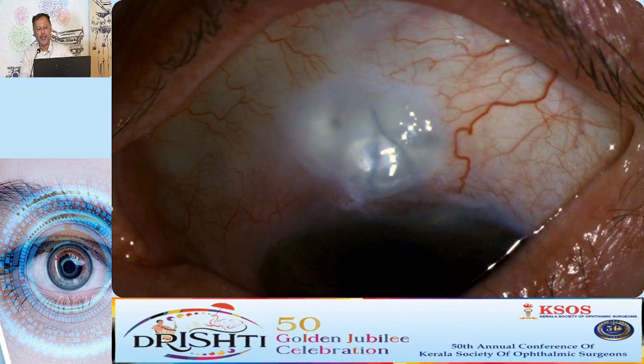This is again another one that requires surgery. So as you can see here, I use a strategy. I use no mitomycin in someone like this because I want that bleb to look a little more vascular if possible. I want that bleb to fail a little bit. That pressure is very low. It's running at around 4 or 5. If it goes up to 7 or 8 or 9 or 10, I don't have a problem. I don't lose any sleep over that.